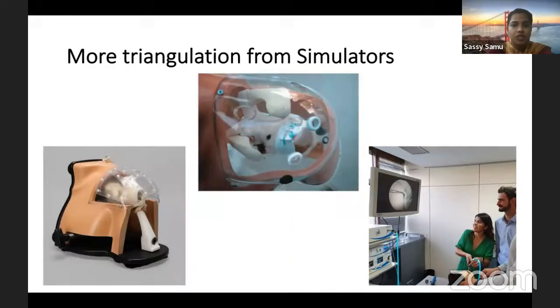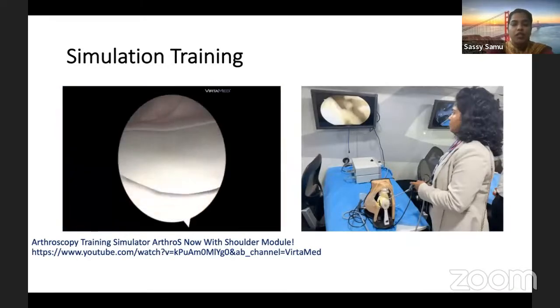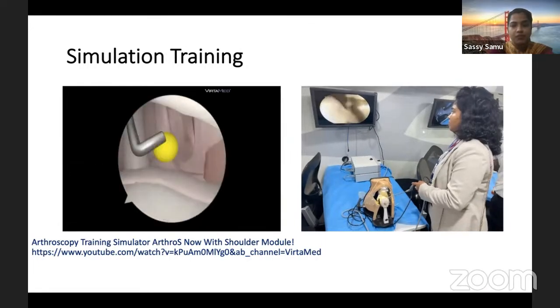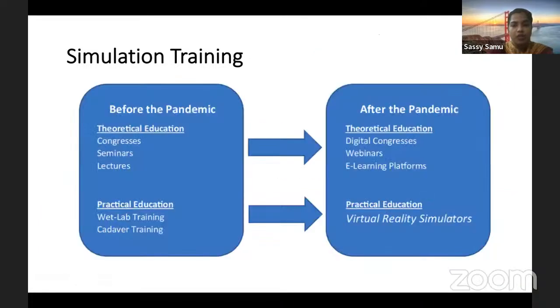Once you are familiarized with the subject, start getting into triangulation skills by having access to the local simulator labs, which will be available at the congresses or at your fellowship centers. This will help you to better orient the triangulation skills and master each simple surgical step, either under your supervisor's guidance or individually in the simulation labs. By performing arthroscopic simulation skills, you will be able to achieve better hand-eye coordination and better orientation of the joint, thereby decreasing the incidence of intraoperative complications.